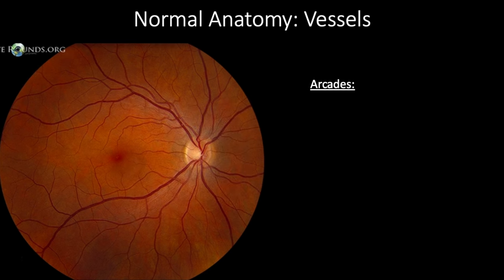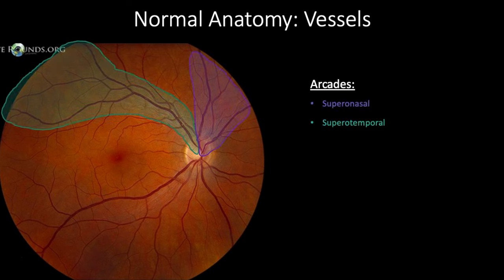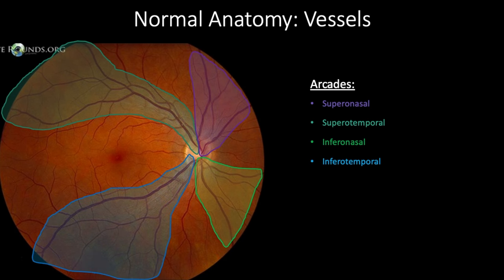Our next area of interest are the vessels of the retina. The central retinal artery and central retinal vein emerge from the optic disc and branch into four arcades: supranasal, supratemporal, infranasal, and infratemporal vessels.